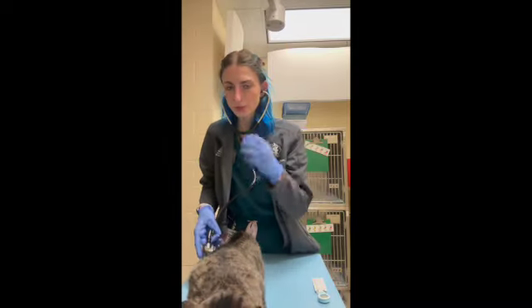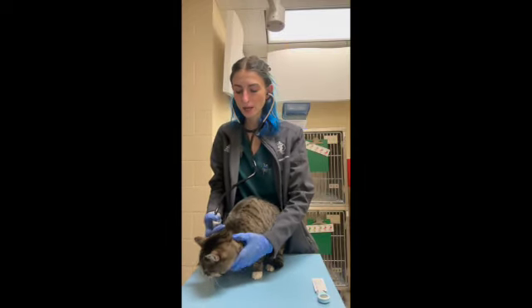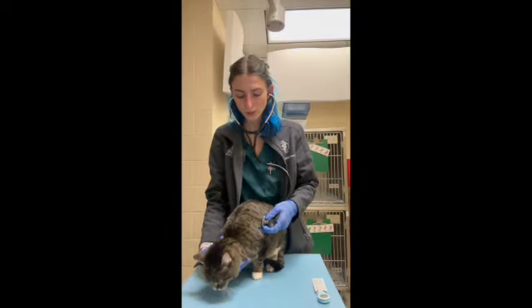All right, so now we've ausculted the heart, and I've made sure that I listened to the heart while also assessing her pulses to make sure that there's no pulse deficits. I'm gonna go ahead and start listening to her respiratory tract.